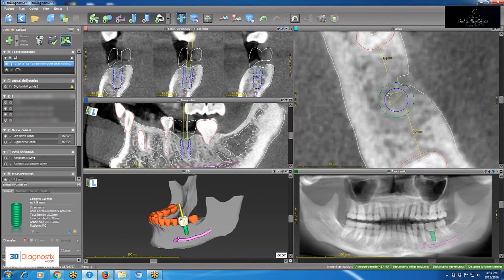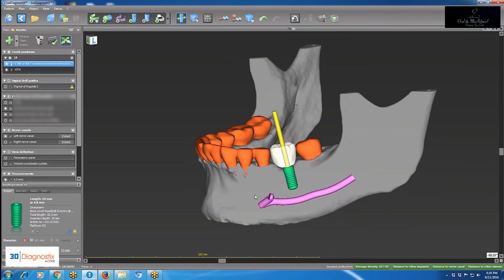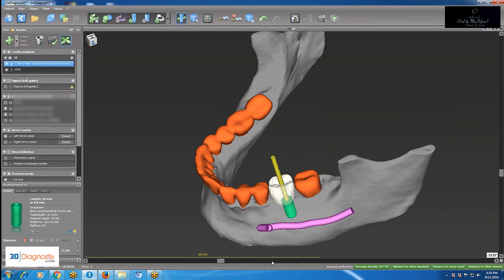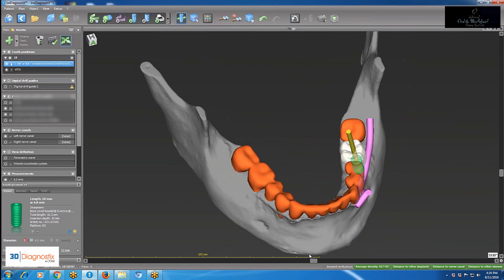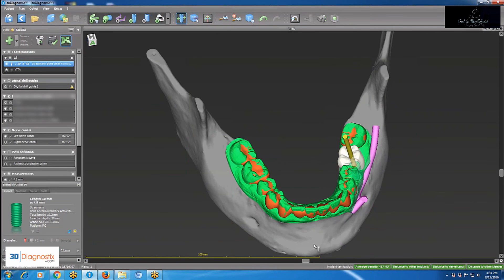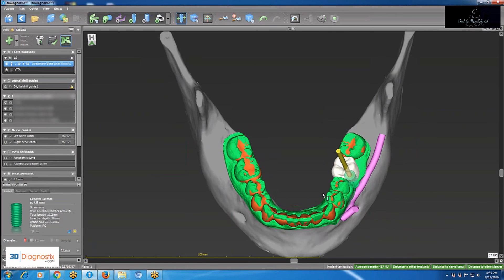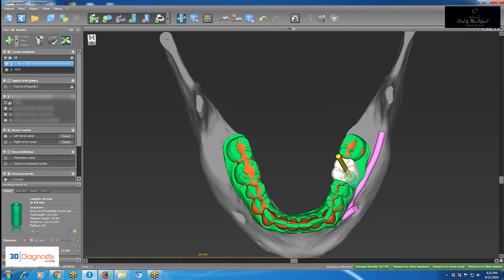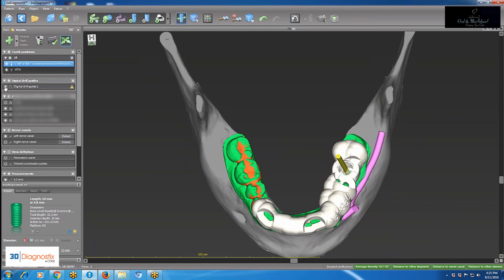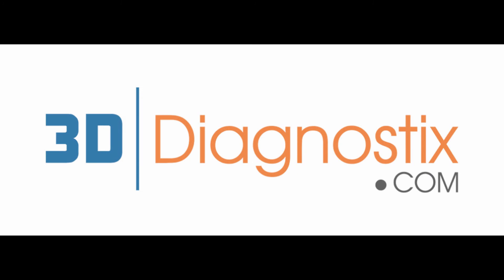In the 3D view it appears well-centered mesiodistally and buccolingually. Once done with the plan, the next step is to register the tooth models onto the plan in order to fabricate a surgical guide. Finally, a surgical guide is fabricated by 3D diagnostics, compatible with the Straumann Computer Guide Kit.